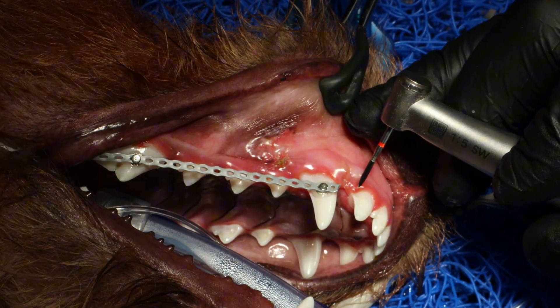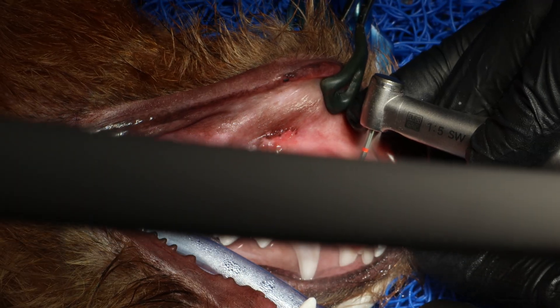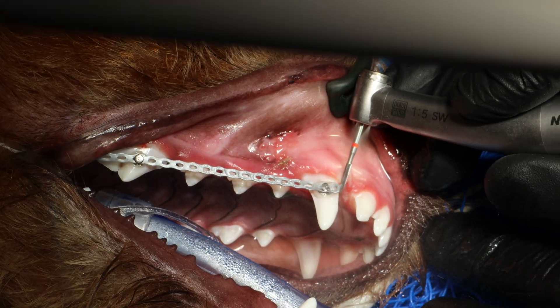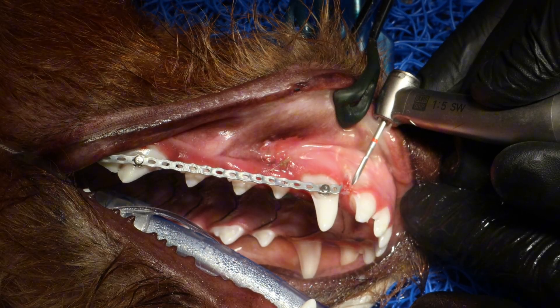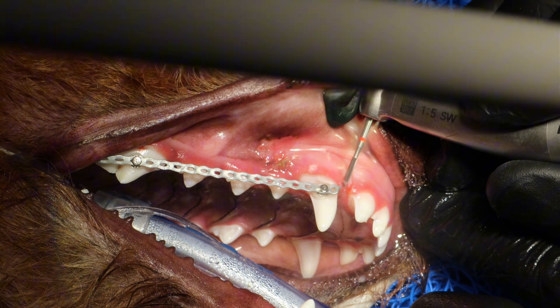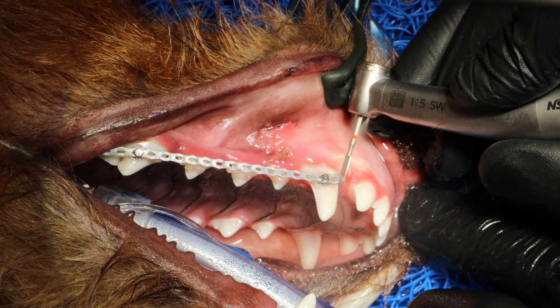What I'm doing here is using a gingivectomy burr to do an auto incline plane — a little gingivoplasty to make space for the tip of 404 so it no longer catches in a hole. You make kind of a slope to force it to tip outwards.